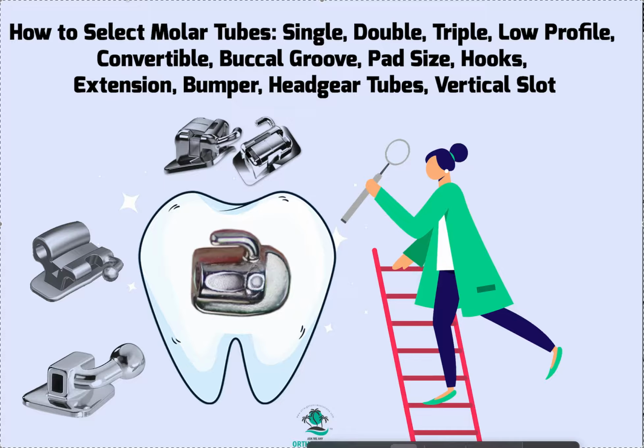In general, everything comes in sets, so you can order from any major orthodontic company, your TP Ortho, your Ormco, your Henry Schein, etc. They have basic stuff in sets, and just get the ones that come in the set, basically. But sometimes there's variations you have to pick from, and it can get confusing. I would just recommend asking the rep to pick the most simple one.